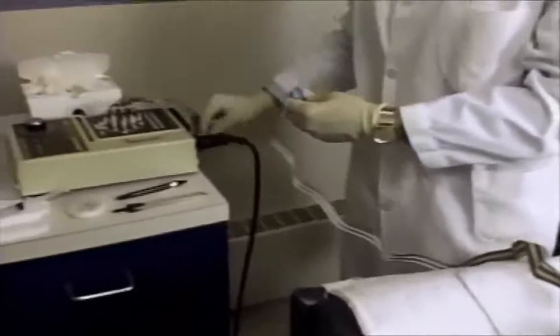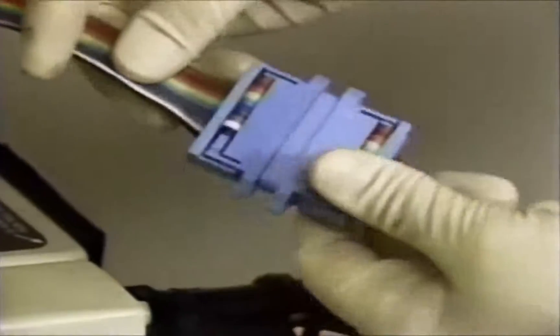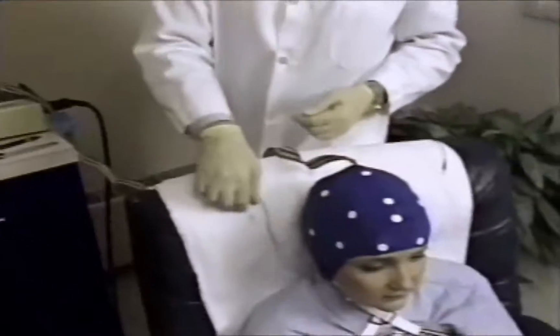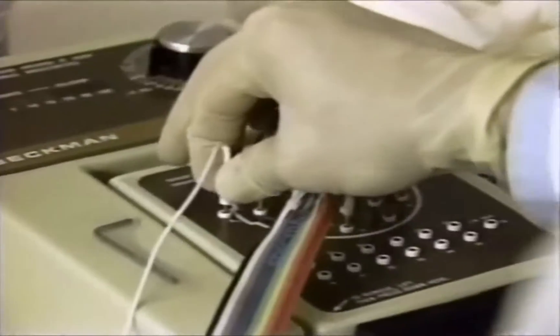Attach the blue connector end of the cap to the blue electrode board connector. At this time, connect the A1 and A2 ear electrodes into the appropriate positions on the electrode board.